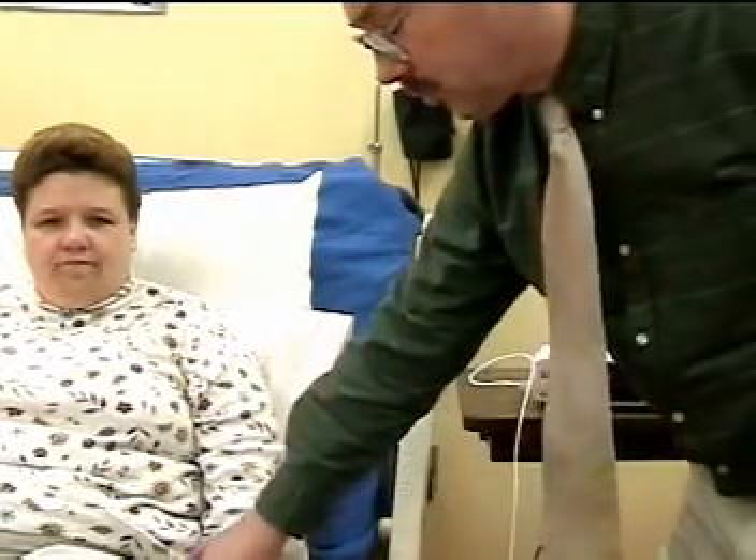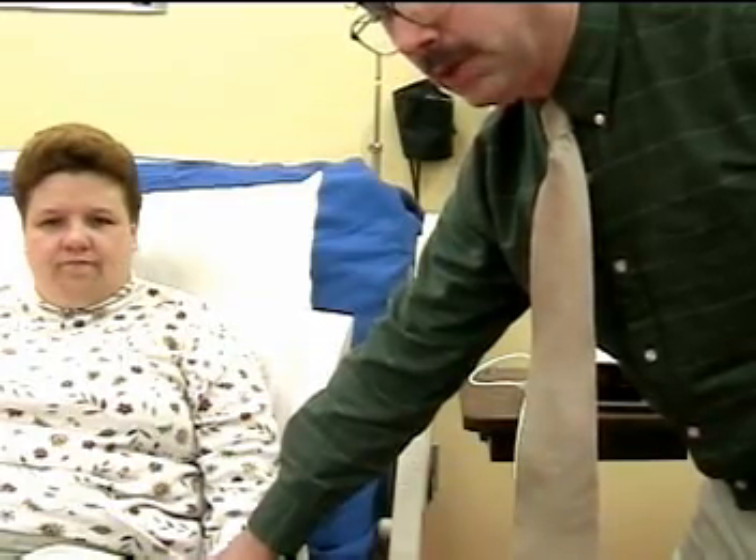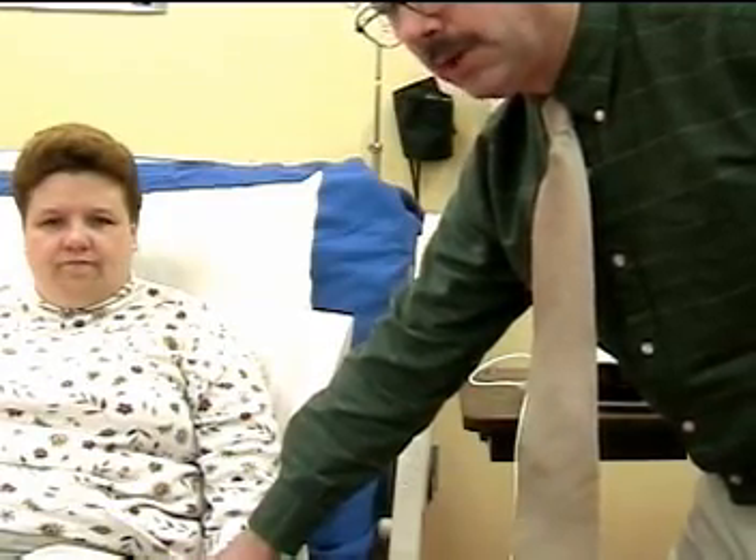Observe for the appropriate waveforms, and to confirm the waveform, check with the patient's pulse. The pulsing and the beeping of the oximeter should be the same. If not, you may be getting an artifact and incorrect readings. Set your alarms according to each individual.